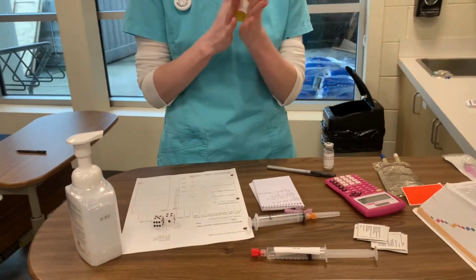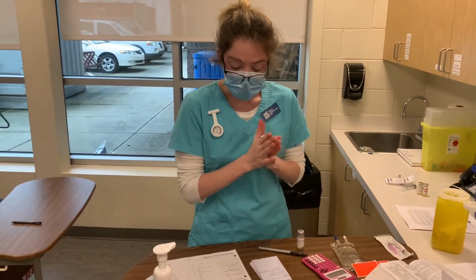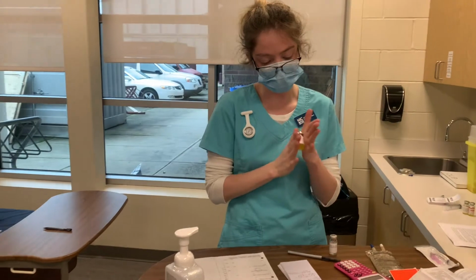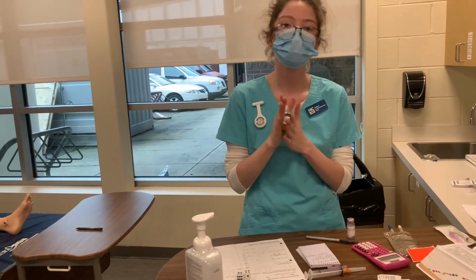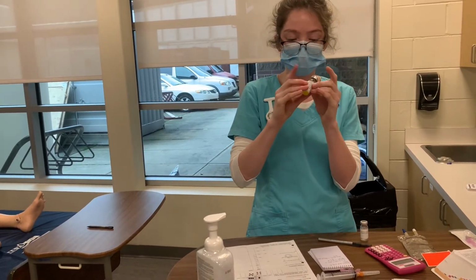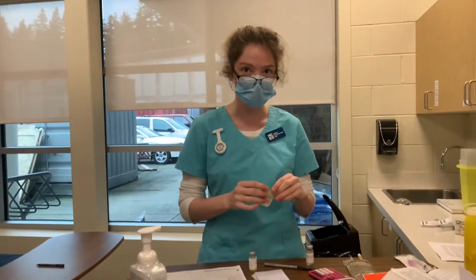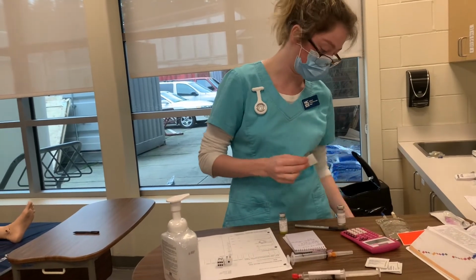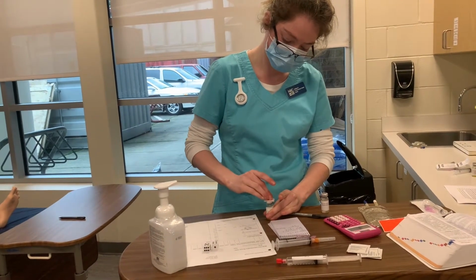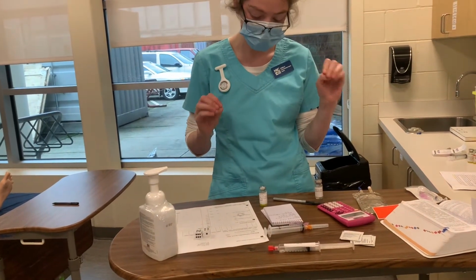Safety cap on, and I'm going to agitate it to mix the medication with the reconstitution fluid so that the dose is accurate. Now I just make sure it's all diluted in there, and it is. And because it was just in my hands, I'm not sure if I touched the top or not, so I'm just going to sanitize it again just to be certain. And I can discard that. And I wait for it to dry.